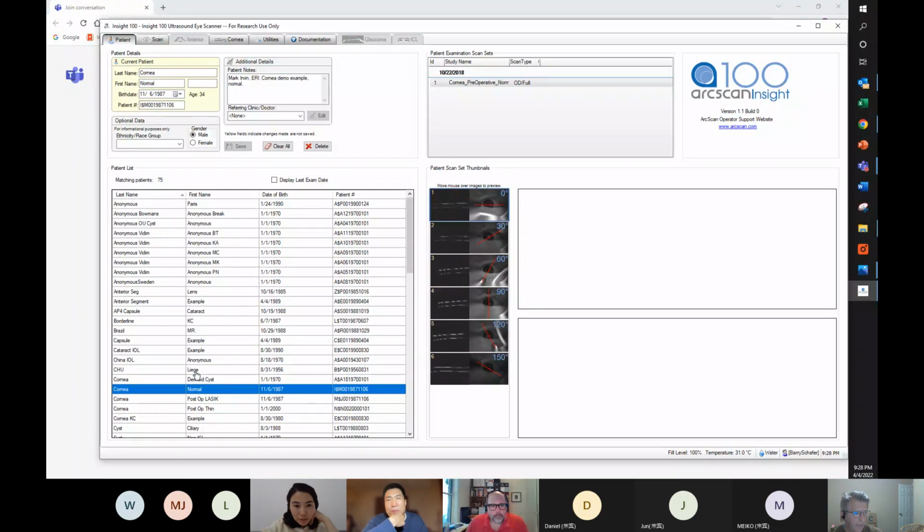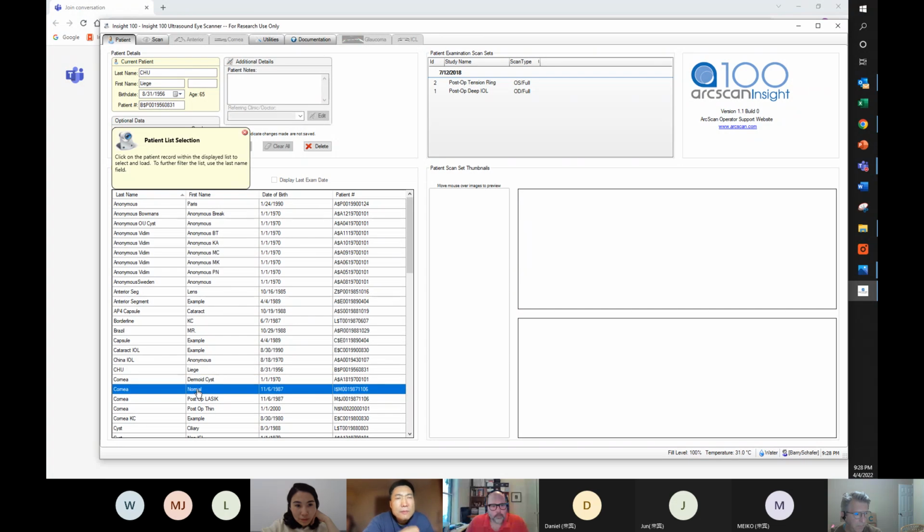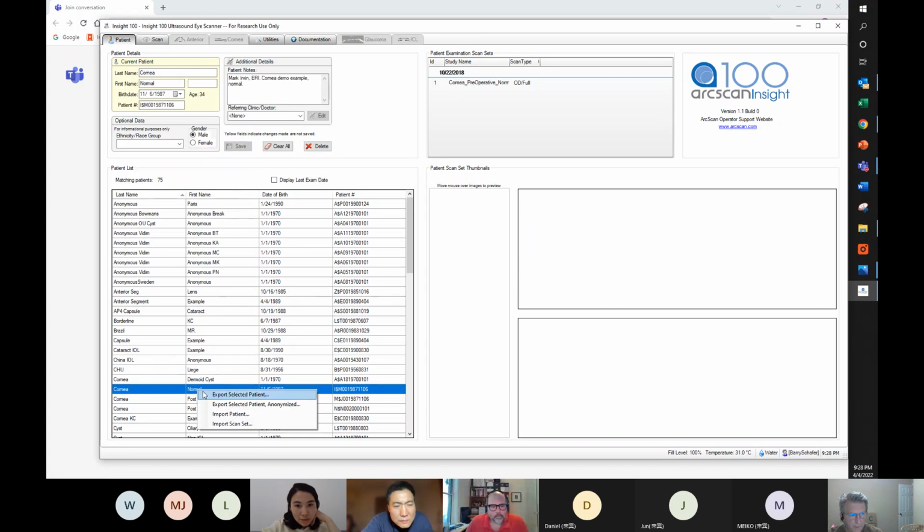Okay. Do you want me to show you how to do that real quick? Yes, please. Okay, it's right here. From the patient screen, let me share. From the patient screen, you just highlight the patient name and you right click. You can export the patient.